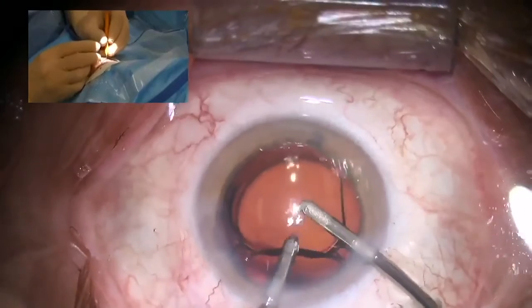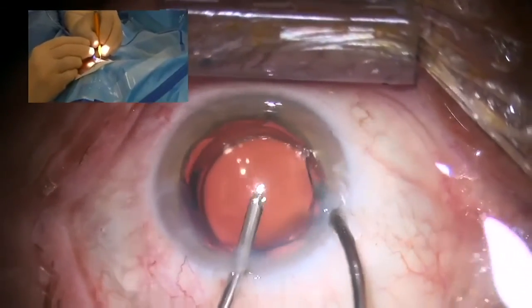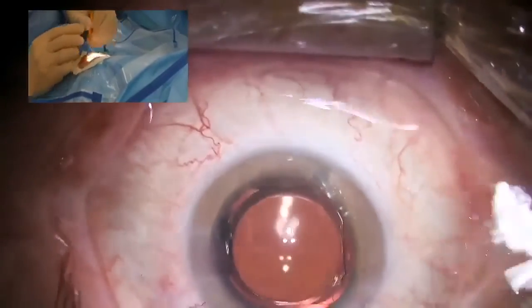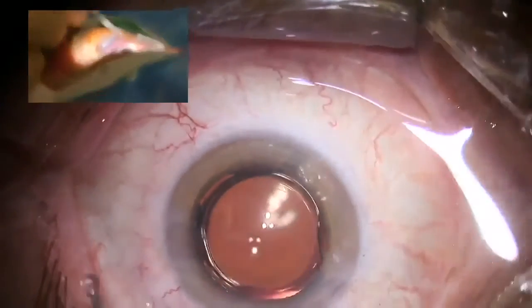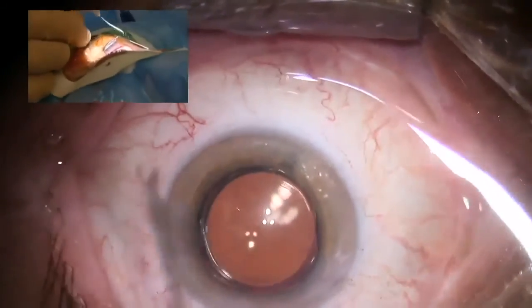This is very important for me to check that there's no viscoelastic remnants between both lenses. So, here you go.